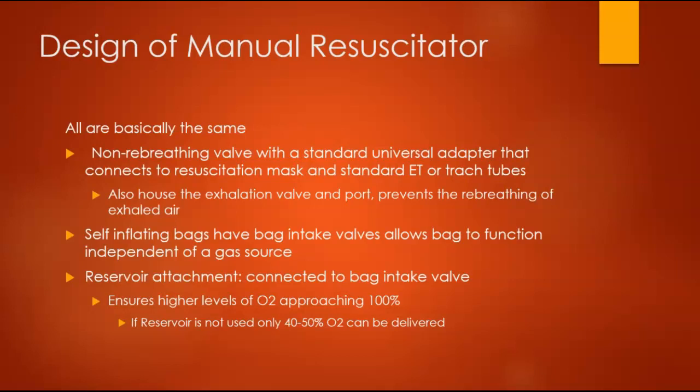They also typically house an exhalation port. This prevents rebreathing of the exhaled gas. When you're using a self-inflating bag, which is what we typically use for adult patients or on transport, they have intake valves that allow the bag to function independently of a gas source. That means I don't have to have it hooked up to oxygen or air in order for this bag to work, which is super important during transport, because if you lose your gas source, you lose your ability to ventilate if you don't have a self-inflating bag with you.